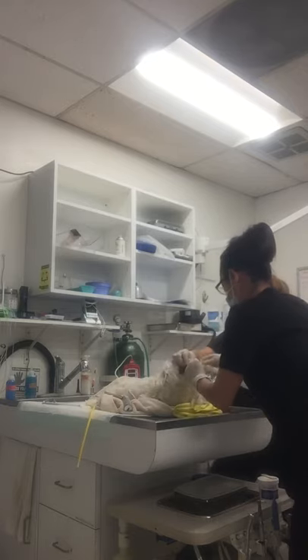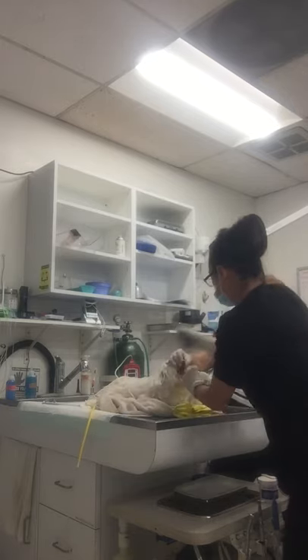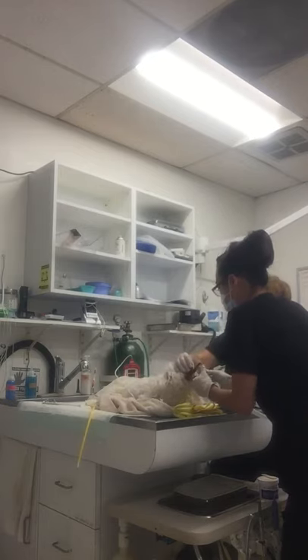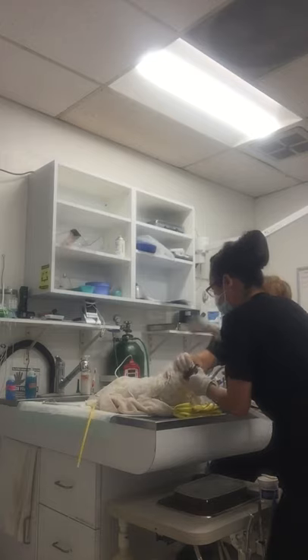I'll have my assistant hold the head open for me, and I'll use my laryngoscope to visualize the esophagus. I'm going to place the laryngoscope just over the trachea tube and lower the trachea tube, and that should show me where the esophagus is.